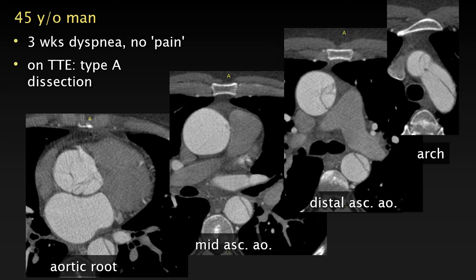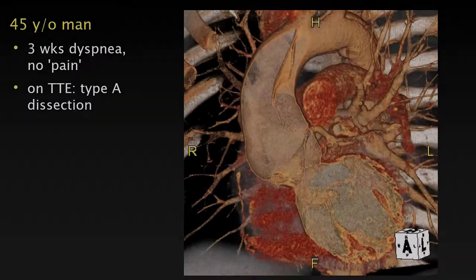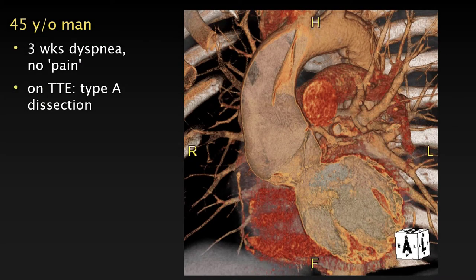Another helpful example: a patient with atypical symptoms where transthoracic echocardiography suspected a type A dissection but wasn't sure. On CT, you see a linear filling defect at the aortic root and some dissection flap in the ascending aorta, arch, and descending aorta, but it doesn't make sense on axial images alone. With a 3D image, you can clearly identify the dissection flap descending from the arch into the ascending aorta — and the remainder of the flap is actually prolapsing through the valve frame. This is much better seen in 3D than on 2D images.